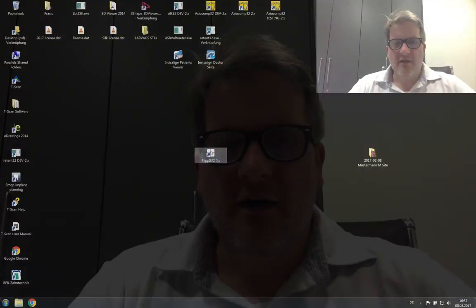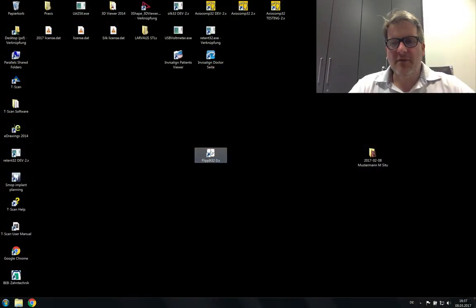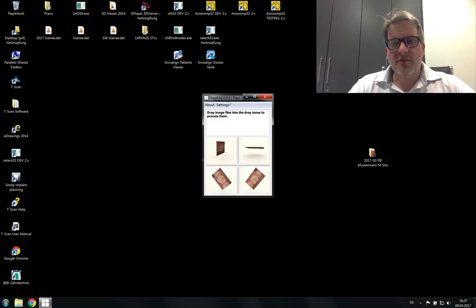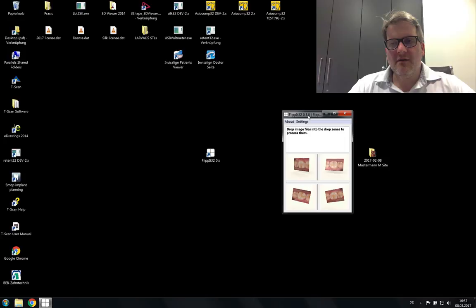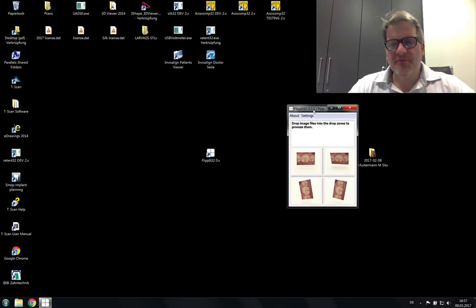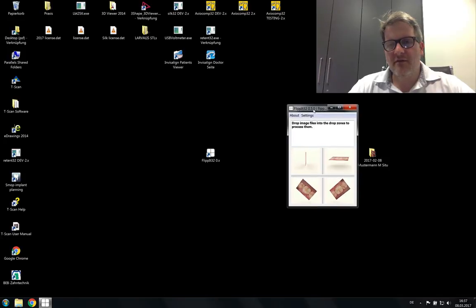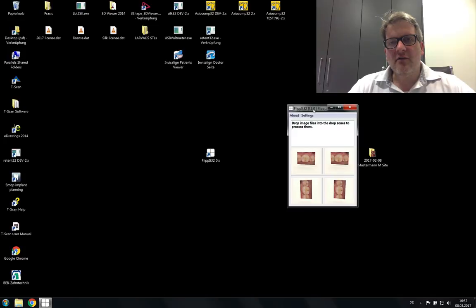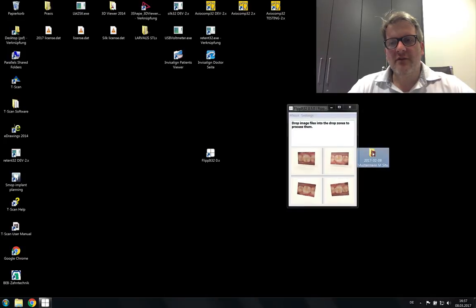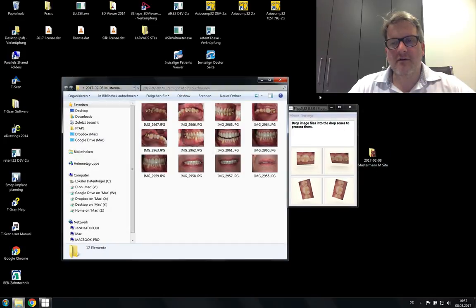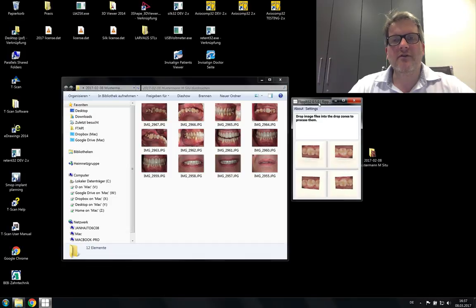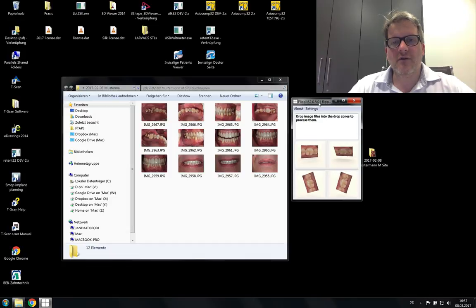So to solve this problem I have created a small application. You see it here on the desktop. I call it FlipIt. And when you open it up you see what it does. You can mirror an image horizontally or vertically and also rotate or un-rotate it in both directions clockwise and counterclockwise.